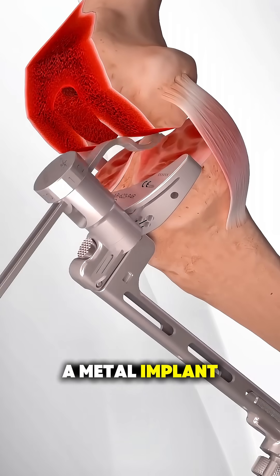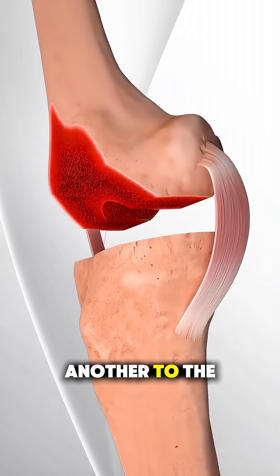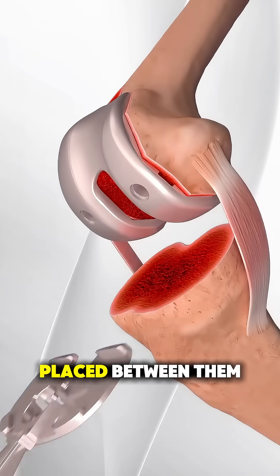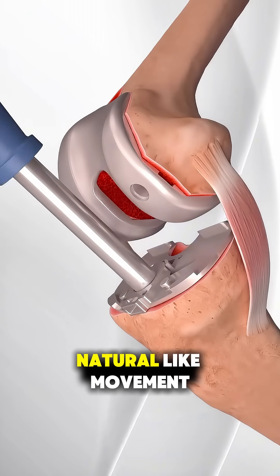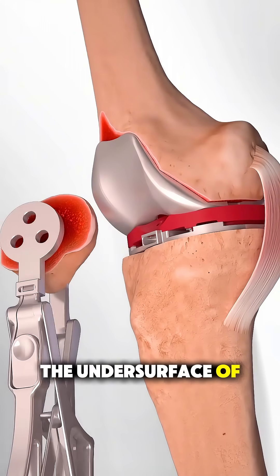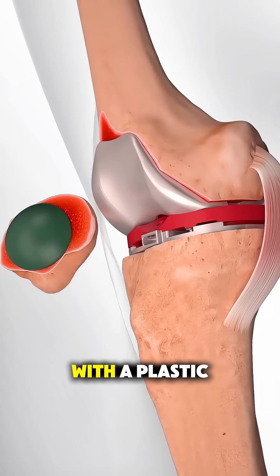A metal implant is attached to the end of the femur, another to the top of the tibia, and a smooth plastic spacer is placed between them to allow easy, natural-like movement. In some cases, the undersurface of the kneecap is also resurfaced with a plastic button.